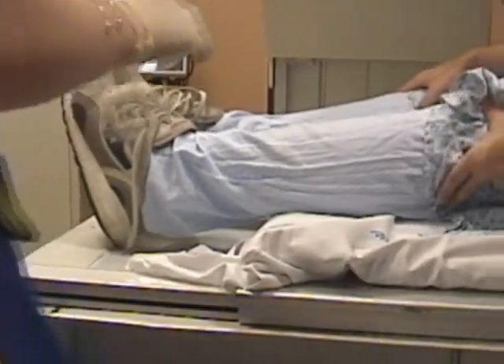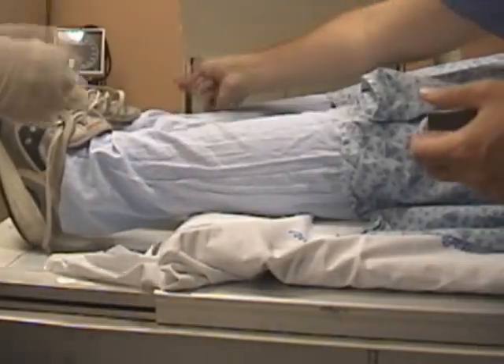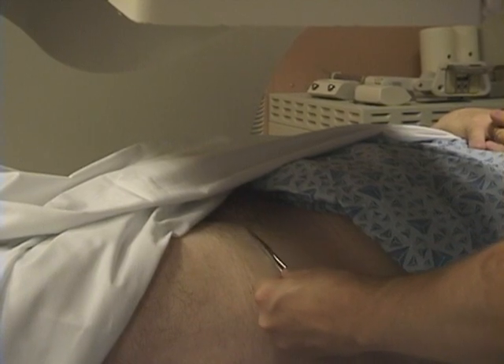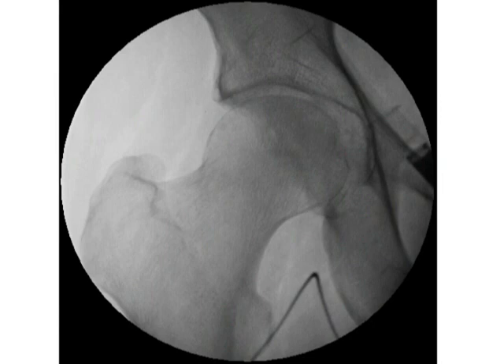For hip arthrograms, place the feet in the internally rotated position. This time, instead of a paper clip, we will localize it with a clamp. Choosing a point for the hip is as easy as choosing a point for the shoulder. We can divide the femoral head and neck into one half, then make a 90 degree line to divide it into another half, and essentially choose a point in the upper half of the head-neck junction.